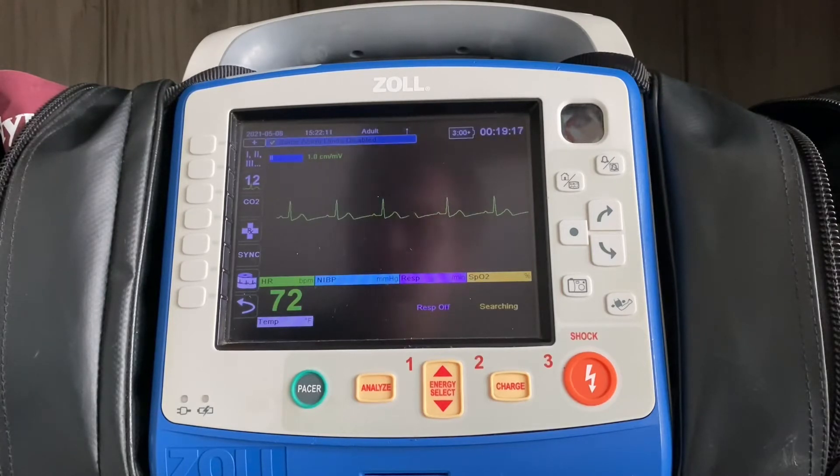By default, the monitor will start up in pads, and as soon as you place the fourth limb lead, it'll automatically switch from pads to lead two without you needing to press anything on the monitor.